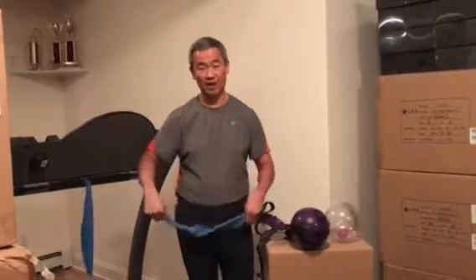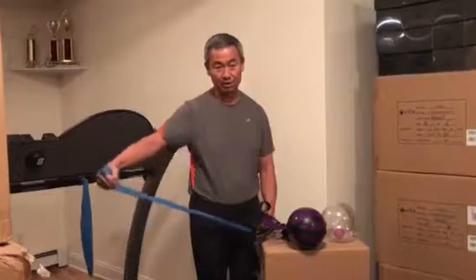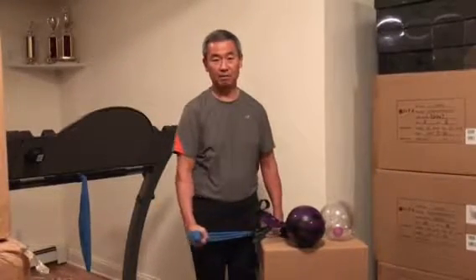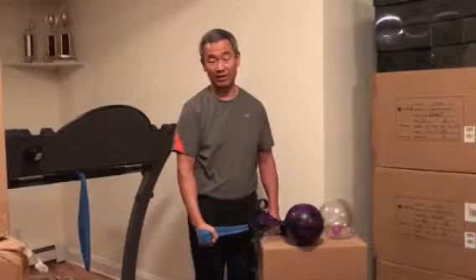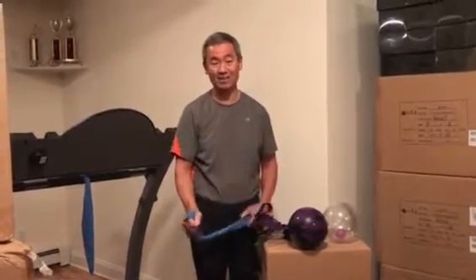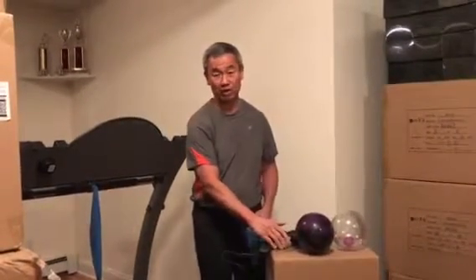The third exercise would be the lateral raises. So they would go from bottom to horizontal, bottom to horizontal. I have timed it so that each motion takes about 3 seconds, which is the same time that the user would use with a ShoulderSphere equivalent workout.